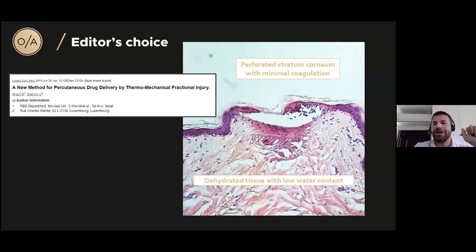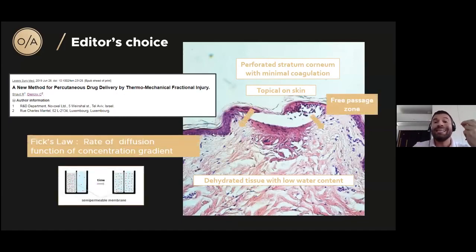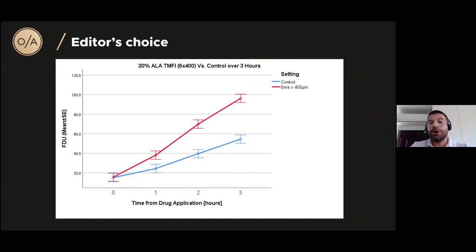We dehydrate the tissue, of course, the stratum corneum, but we're talking mainly about the epidermis. So we have a very low water content. So if we put any topicals on the skin, it will enhance the delivery of this topical. You can see the comparison.